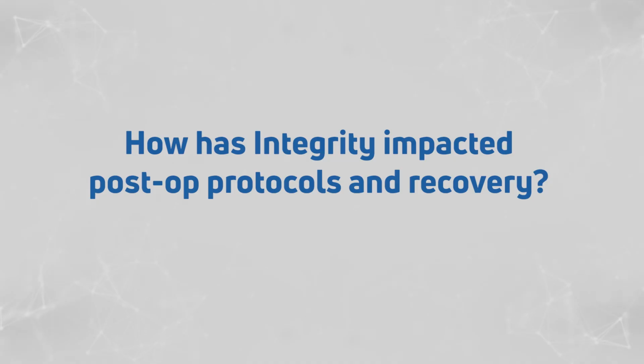I'm still pretty standard. I still try to mobilize them as fast as possible, but what I'm seeing is less edema, less post-operative swelling. I'm still pretty stubborn. I'm old, so I stick to my ways of how I treat my tendons post-surgically. I haven't really pushed the limits on the post-op, like getting them going faster. I still ambulate my insertional Achilles rupture treatments, my insertional spur fixation. I still walk them at 3 weeks. That's still pretty early. My Achilles rupture repairs is 3 weeks as well.